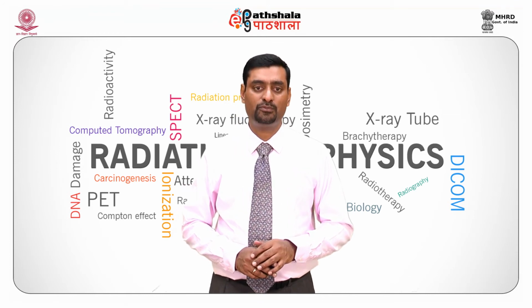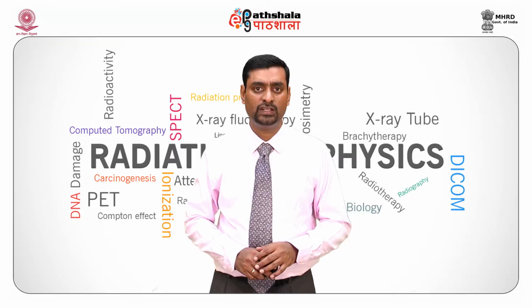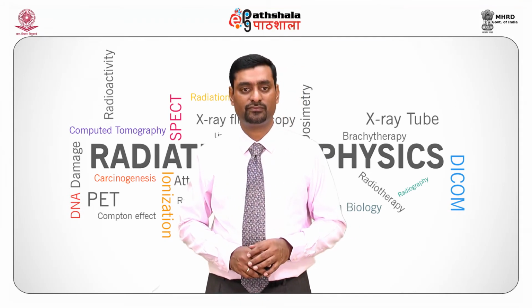This illustrates film processing. The developer has a lid, then there is a rinse tank which has water, running water can be used, then there is a fixer tank, and then again running water. Then there is an on off switch. Very often we have a small thermostat inside in order to warm up these solutions that are present inside the processing tank. Let us move on to developer, which is the first stage of film processing.